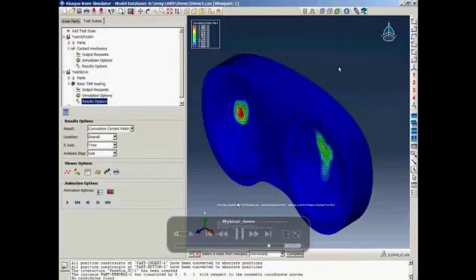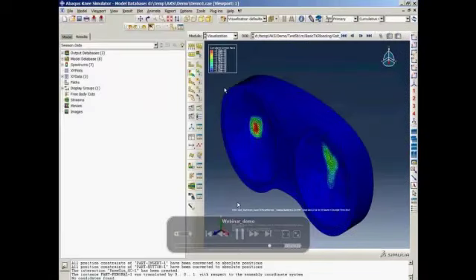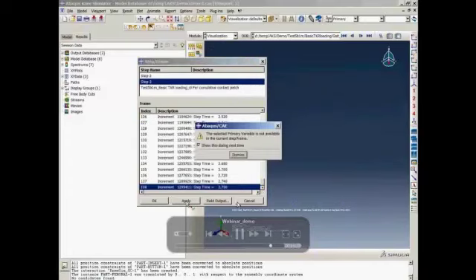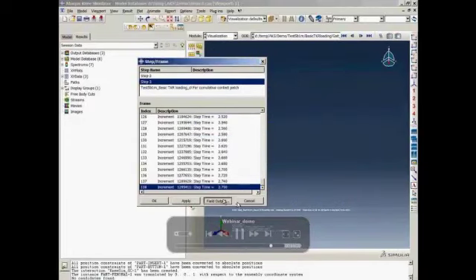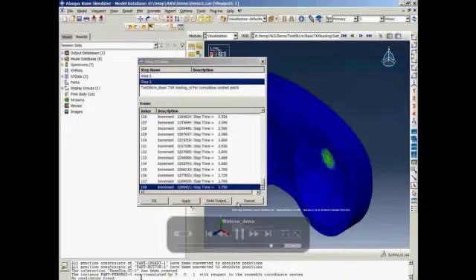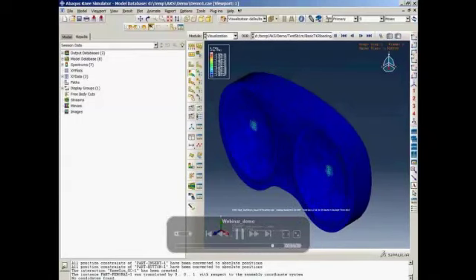And the user can go back to the analyst view to have access to more visualization tools. In this case, I showed how different steps and output variables can be selected to be plotted. Instead of the contact output, I choose the stress output for the components and how it's progressed over the gait cycle. And we can see how the stress is being developed on the insert.